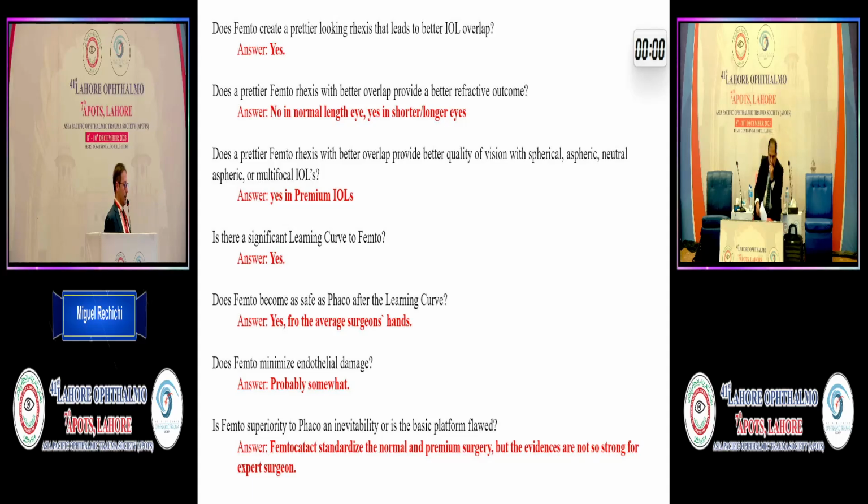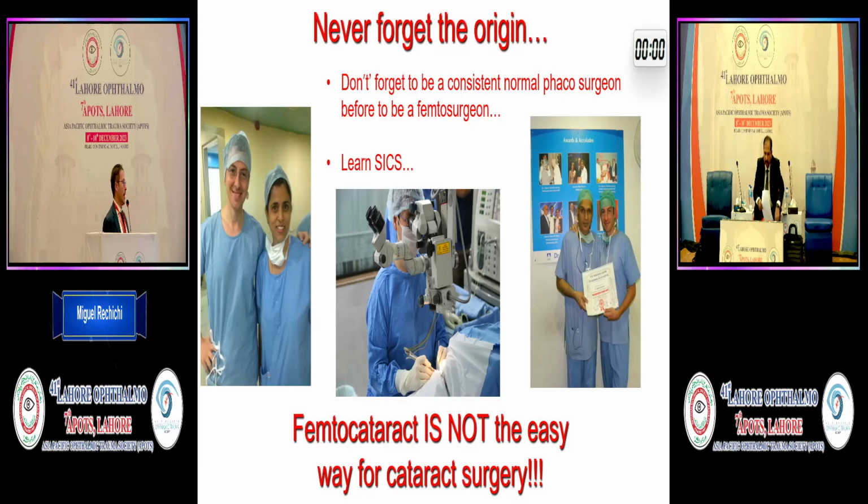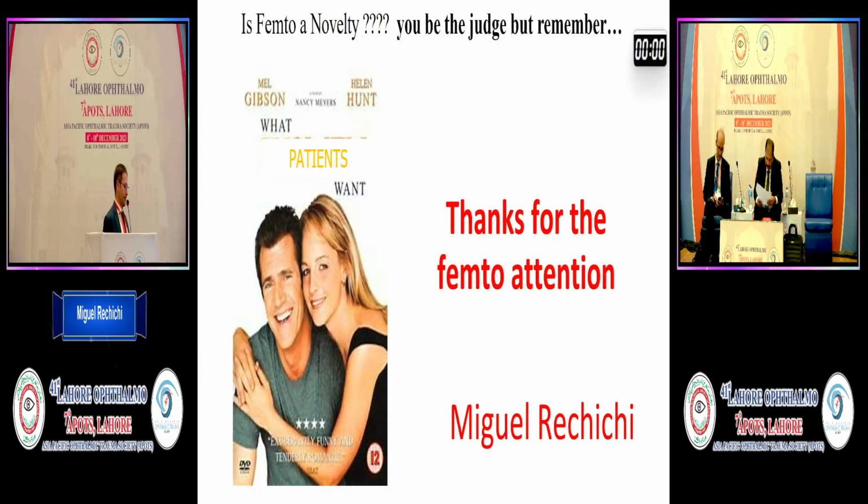And to me, the best use of femtosecond laser cataract surgery is in a hard cataract and in premium lenses. For the normal eye, to me, there is not really a difference, and you must never forget the origin, because before being a consistent femto surgeon, you have to be a consistent manual cataract surgeon. So thank you.